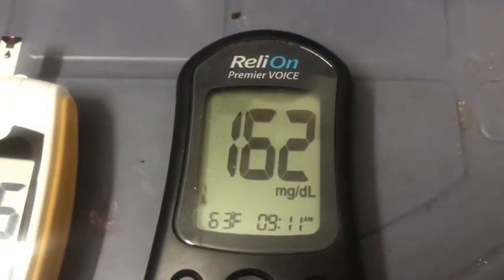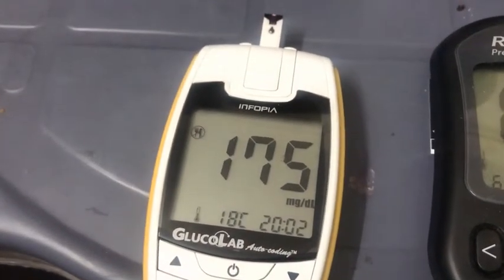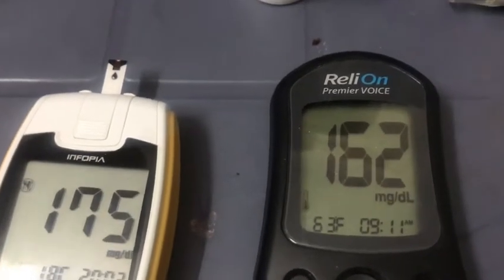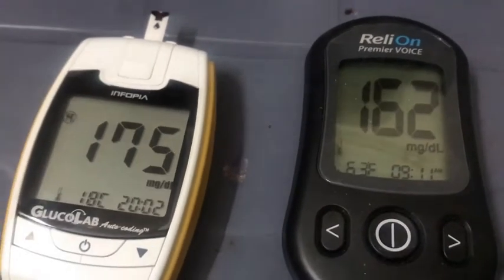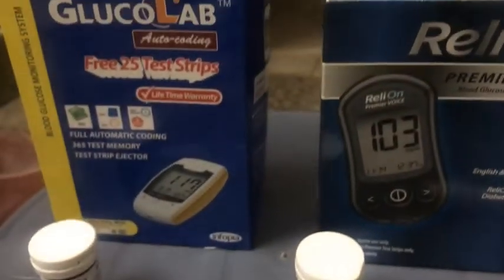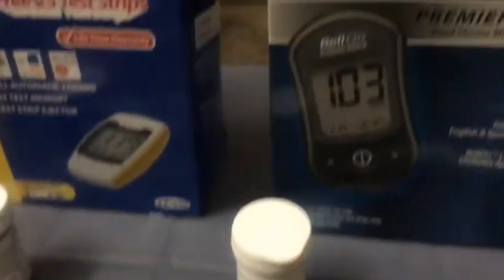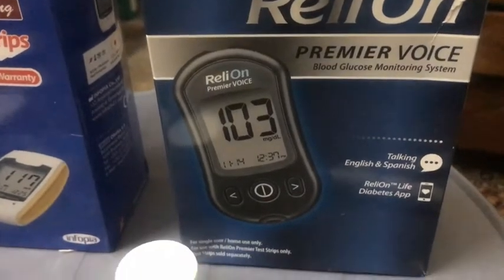The RelyOn reads 162 and the Glucolab reads 175 — so they're really close, differing by only 13 points in the 175 range, which is about a 7% difference. So the Glucolab in Pakistan is basically as good as the RelyOn from America. They're both pretty good and both come at great prices.